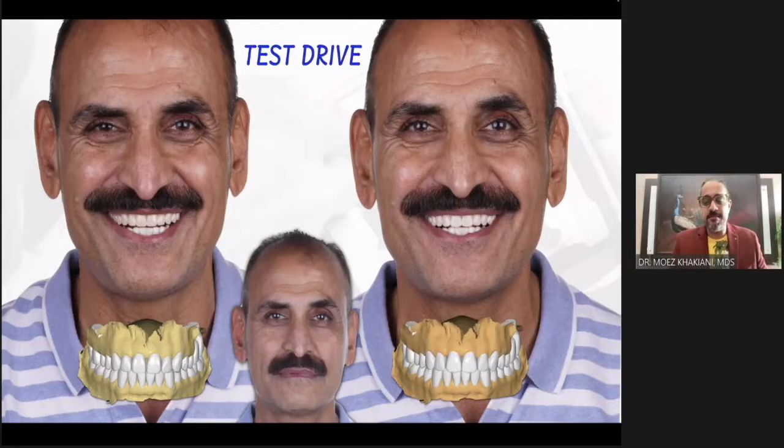And then simply ask the patient, which one of these two do you like more? Do you like the one that has the flattened incisal edge more? And look at what I'm doing, I'm taking pictures here. Or do you like the one which has the more curved incisal edges? And then allow the patient to make this informed decision. You have gone that extra step for your patient.